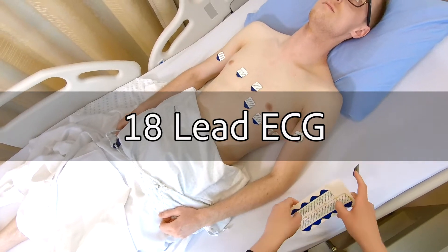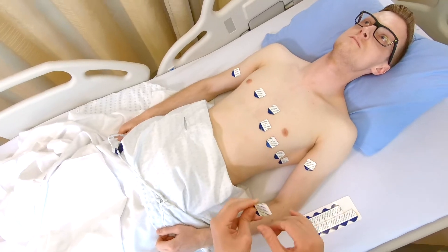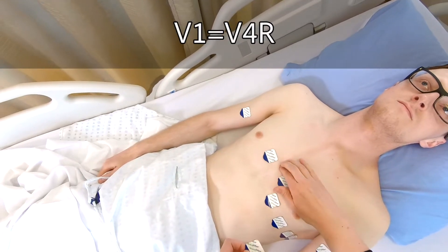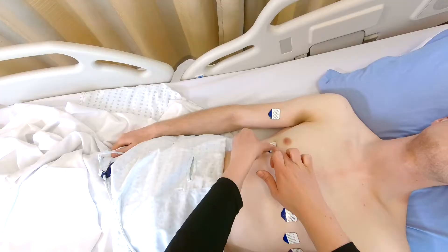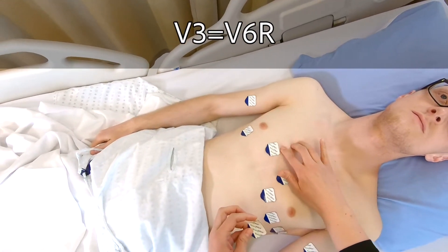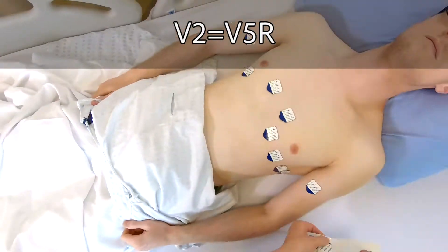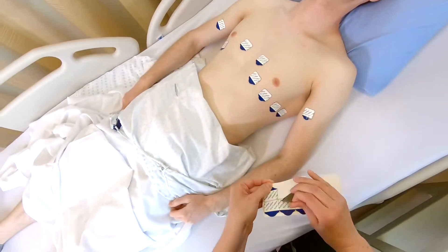An 18-lead ECG may be required following the completion of a 12-lead ECG. These are the changes: V1 becomes V4R, located on the right side, 5th intercostal space, mid-clavicular line. V3 becomes V6R on the right side at the 5th intercostal space, mid-axillary line. V2 becomes V5R on the right side, 5th intercostal space, anterior axillary line.